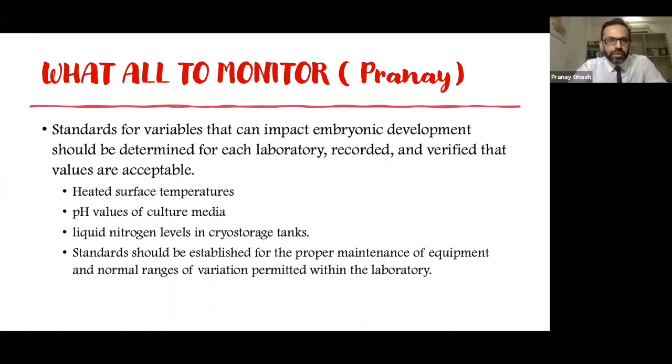We need to measure all the variables of the HVAC system. So air quality monitoring with regards to the enumeration of particles, microbiological contamination levels, and VOC levels. They need to be done routinely, so the frequency of monitoring can be defined, and particle counting can be part of the BMS or the EMS. What is really important is VOC levels, because they can detect non-compliance or a breach of cleaning and disinfection protocols. They can also dictate the maintenance schedule for servicing and replacing your filters, especially after a burn-off. So I think particle counting should include all 3 variables.